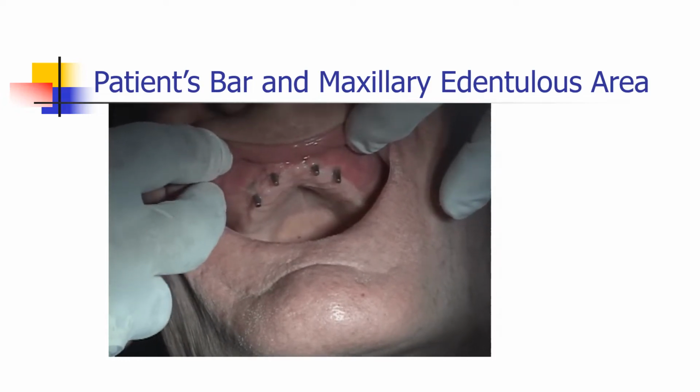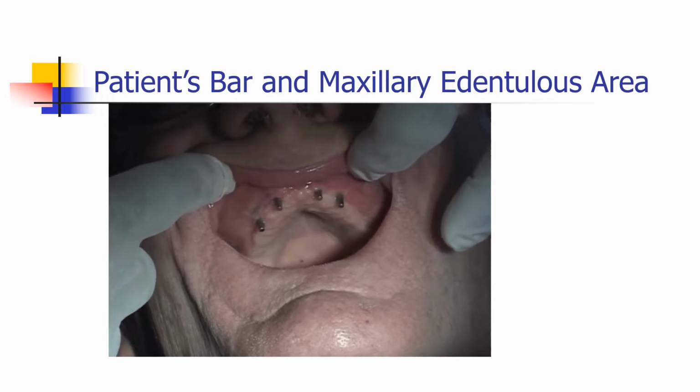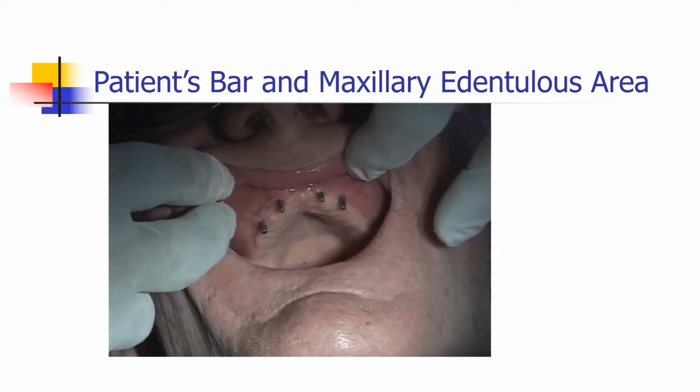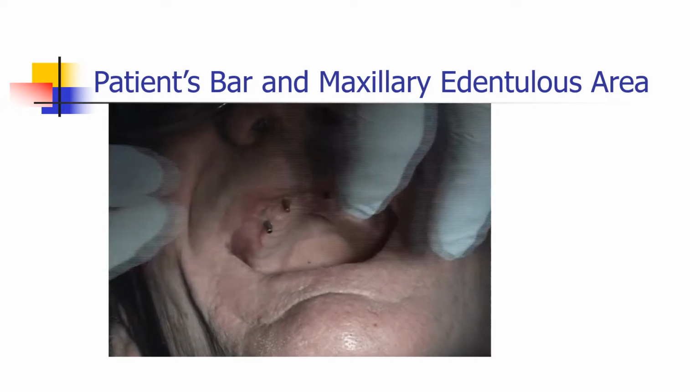Okay, this is Mr. Gray, and he's had a custom endosseal implant placed several weeks ago in his maxilla. And this is one of those situations where the abutment heads were exactly the right size, so we didn't have to trim them down. So we took impressions last time.